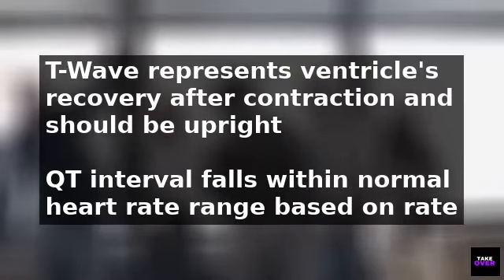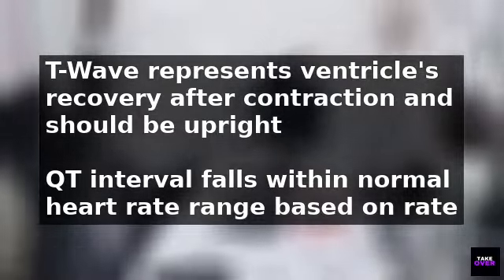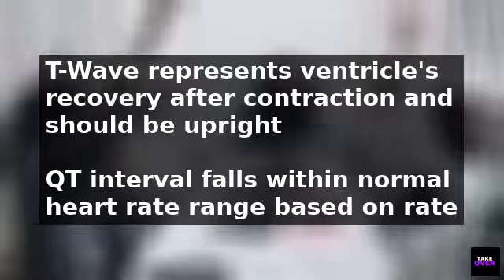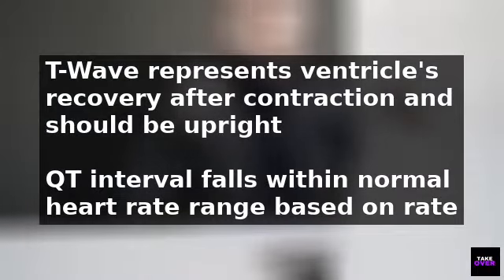By checking these components, one can easily determine if an ECG report is normal. A normal ECG report will have all these characteristics, indicating a healthy heart with no signs of conditions or abnormalities.